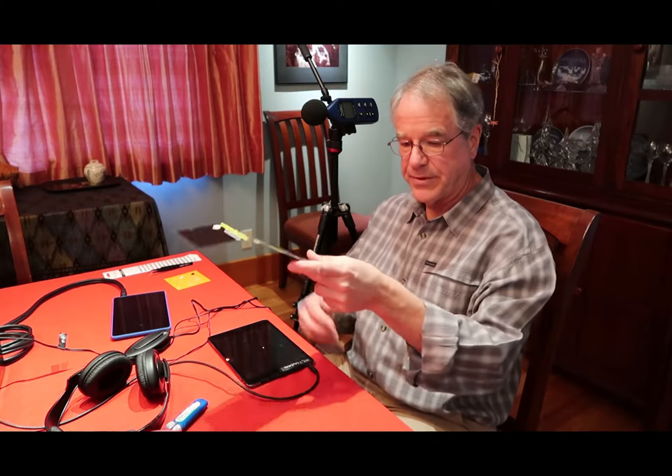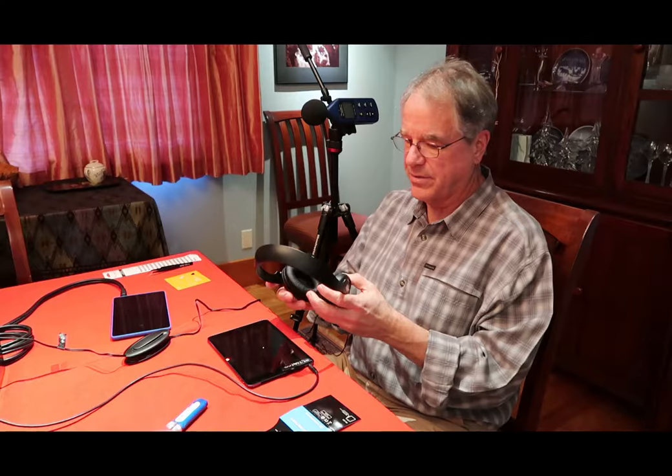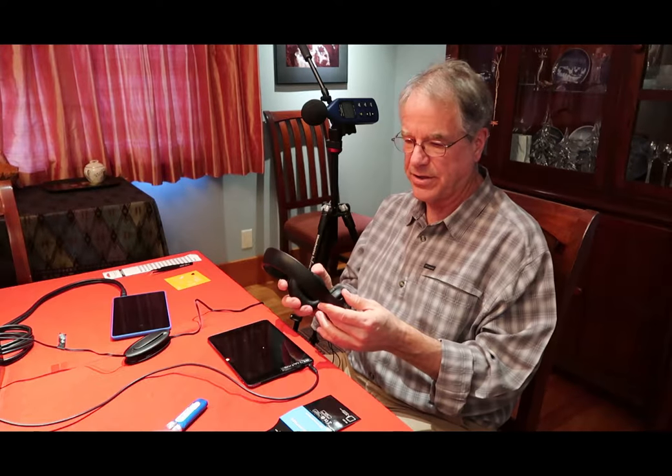I've used two different styles of headphones. Today we're using the HD 202 by Sennheiser. I think this is actually out of print now. So I'm not quite sure what we're going to replace that with. I had also used another headphone previously, but it turned out that it maybe wasn't quite as good at isolating people from the background noise.